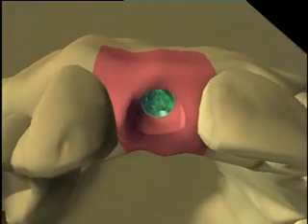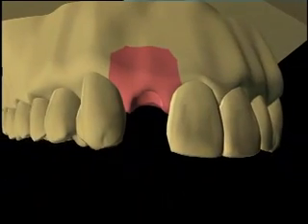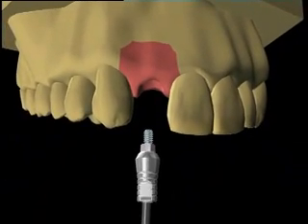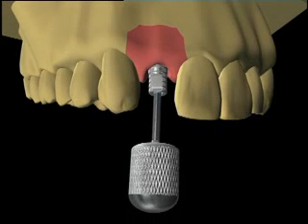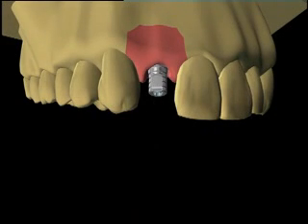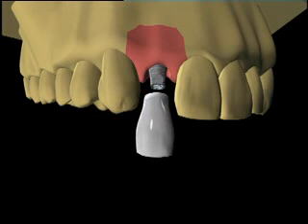Model was created and an analog was positioned into the desired location of the implant. An abutment is chosen and preparations are initiated prior to surgery. Preoperative abutment preparations will help reduce the modifications required on the day of surgery. The treatment planning process contributes the most to the success of this technique.